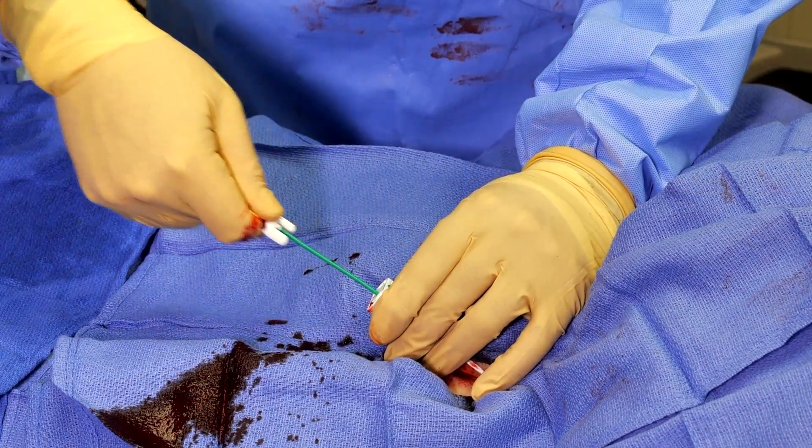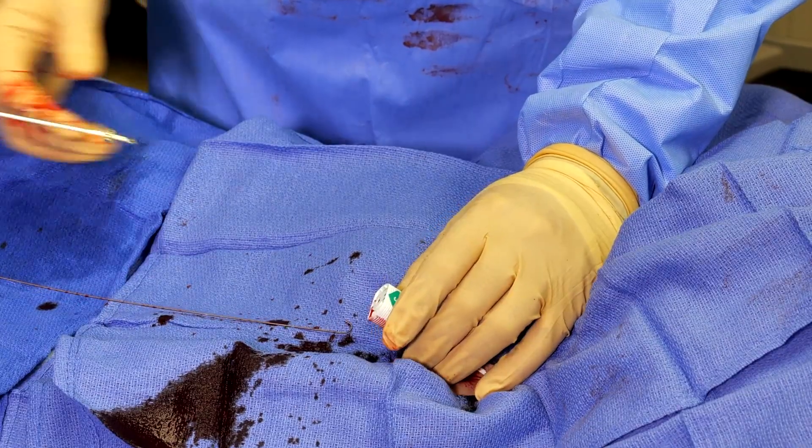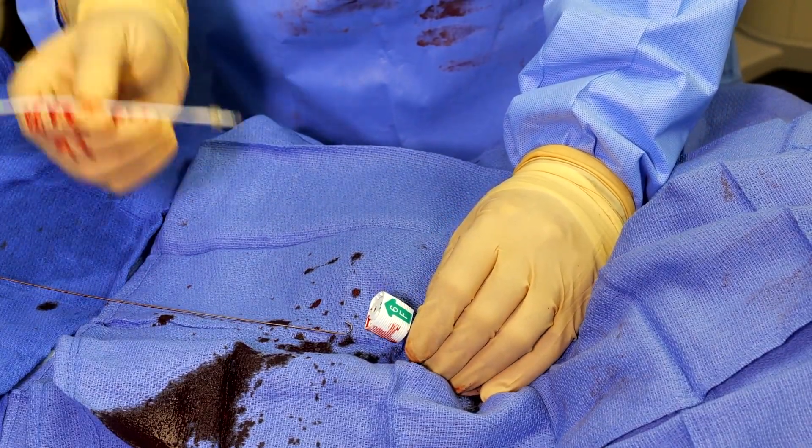I now take out the introducer, or the locator, and the wire. The tip of this sheath is now in the right spot.